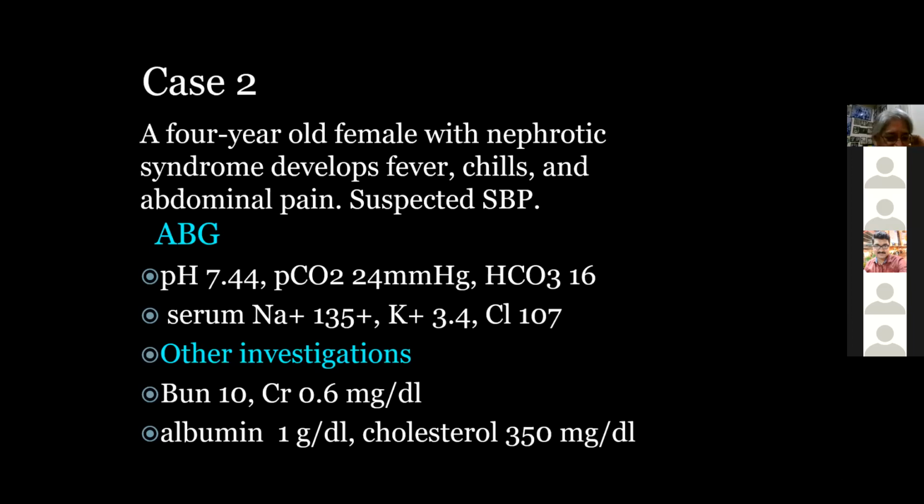Hello, madam. pH is 7.44, which is alkaline pH. PCO2 is less. We'll expect 30. It is little lesser than what is expected. Bicarb is also less. So it is metabolic acidosis along with respiratory alkalosis. So it looks like a mixed picture over here.